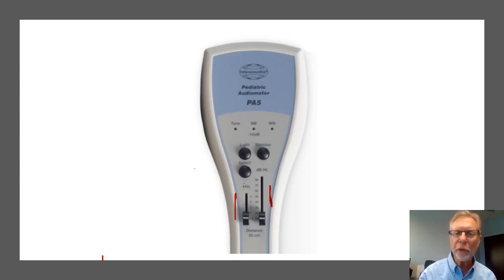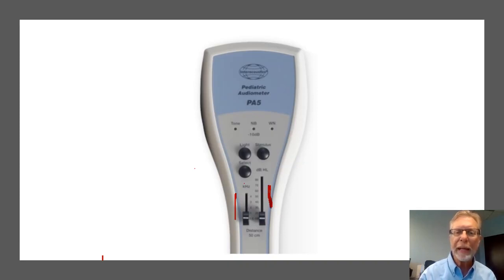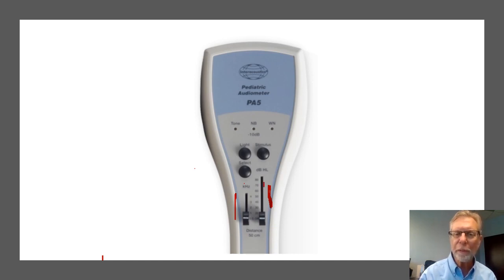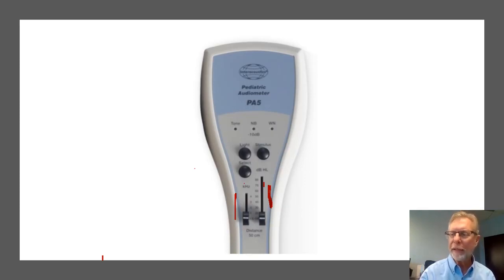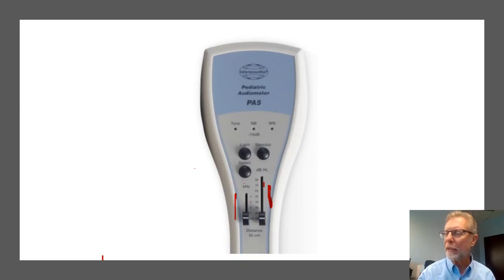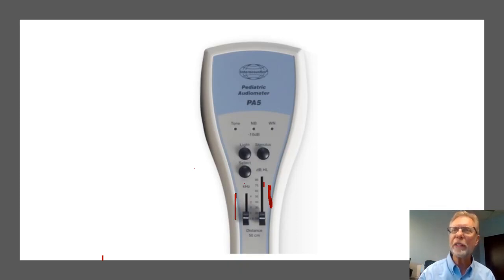The next control, right next to it on the right here, it's a slide control as well, and that's to control the intensity. If that switch is all the way down at the bottom, then you shut the instrument off. As you raise it up, you'll find different intensity levels starting at 20 dB and then 30, 40, 50, 60, 70, and 80 dB.